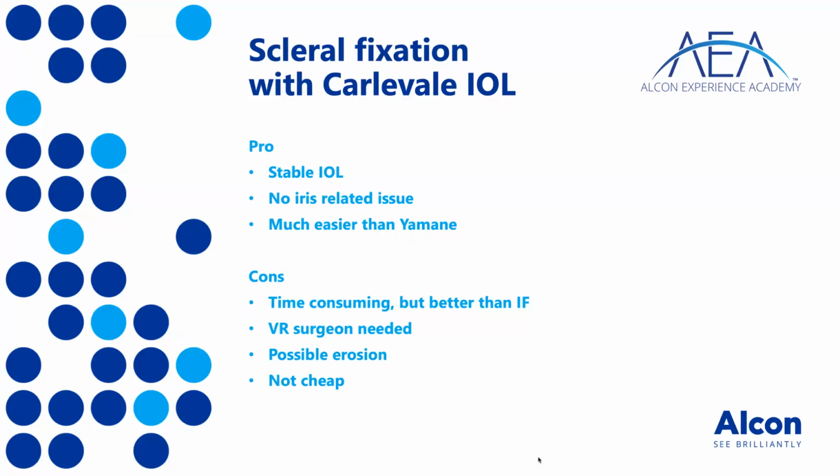So for the moment, to my knowledge, erosion hasn't really been an issue at all, but it might well be if we are talking about 10-20 years down the line. So this is something simply to take into consideration. It's not super cheap. It's a lens which has its cost.